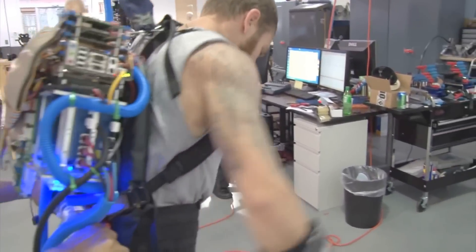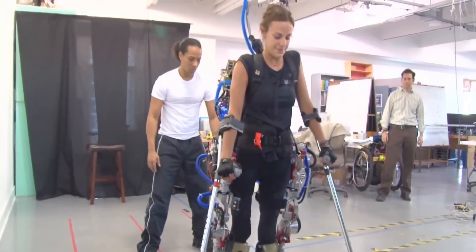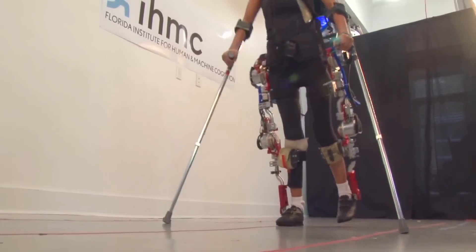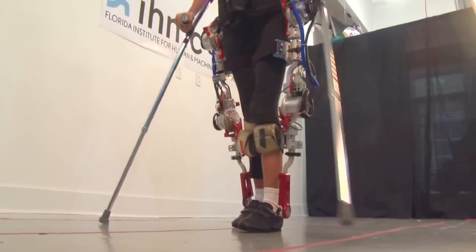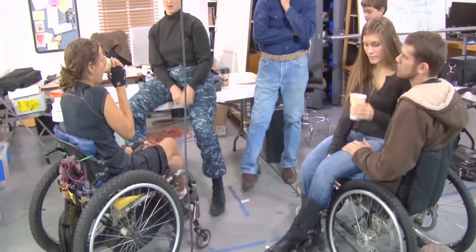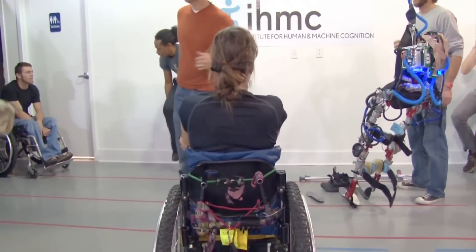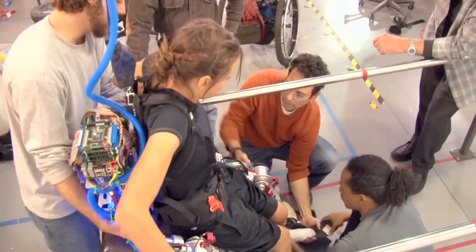Our research started with a mobility assistance exoskeleton with motors at the hips and the knees for sagittal plane motion. We were able to provide mobility assistance for two persons with SCI complete injuries, so they had lower extremity paralysis and were not able to walk on their own.